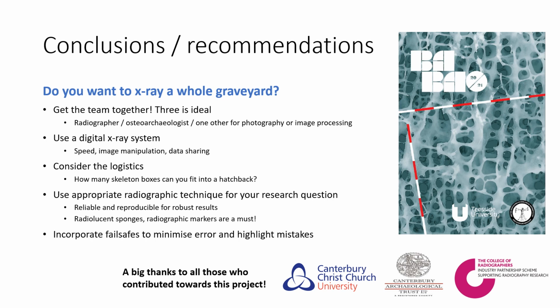Use appropriate radiographic technique for your research. You need to be able to produce reliable and reproducible X-rays for robust results. And then radiolucent sponges and radiographic markers are a must for the best quality images. And lastly, incorporate fail-safes to minimize error and highlight mistakes, because if you have a problem with your data, you need to be able to work backwards to find out whether it's affected all the data or just a few of them.